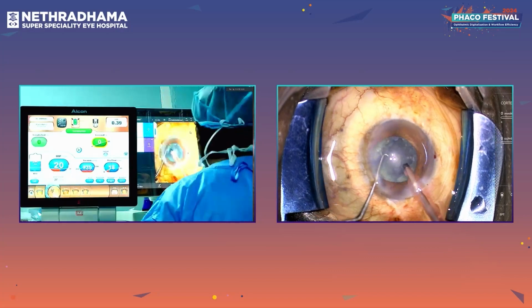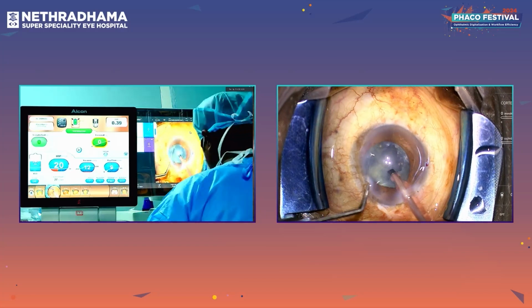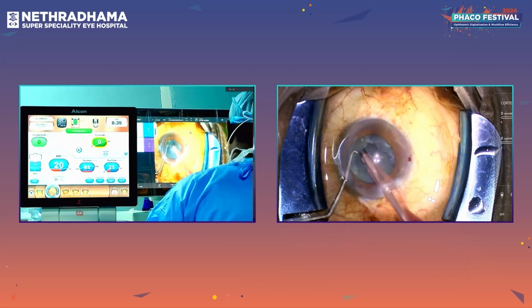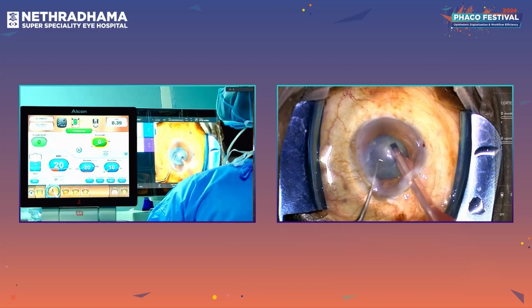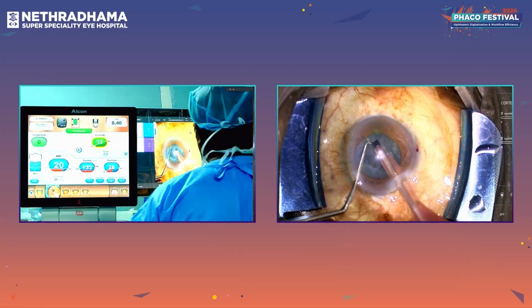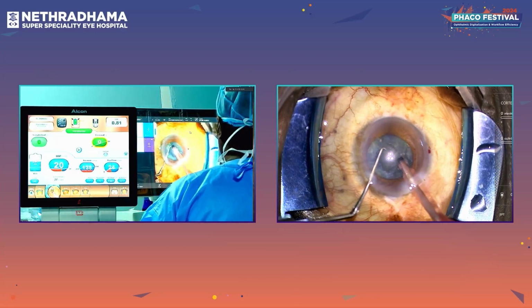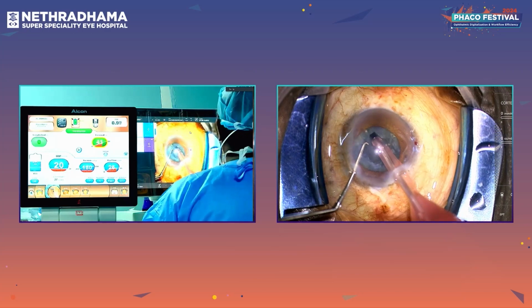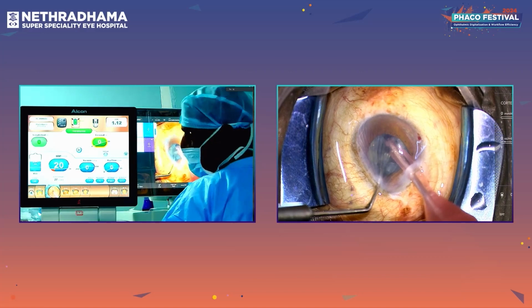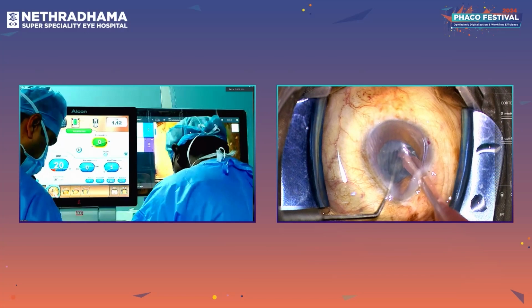Somehow not been able to achieve a crack of the posterior plate, which is too soft to be chopped and too hard to be trenched. We'll just try to trench it a little bit very carefully at the center, so that we get a good division out in the center.